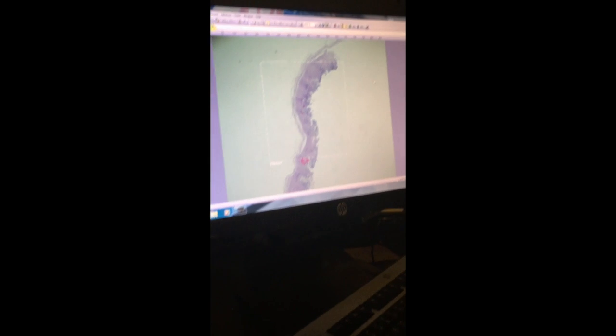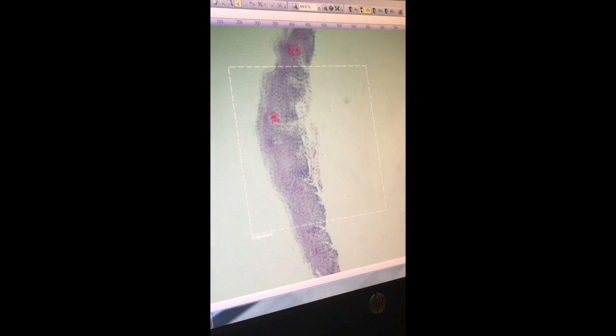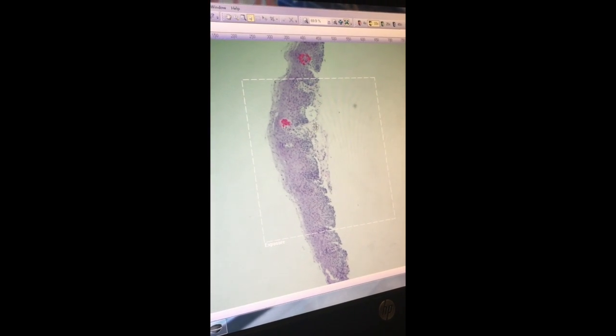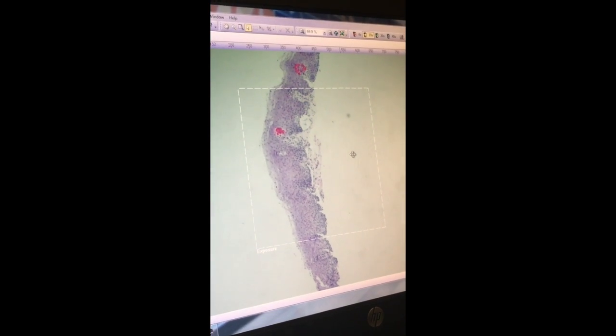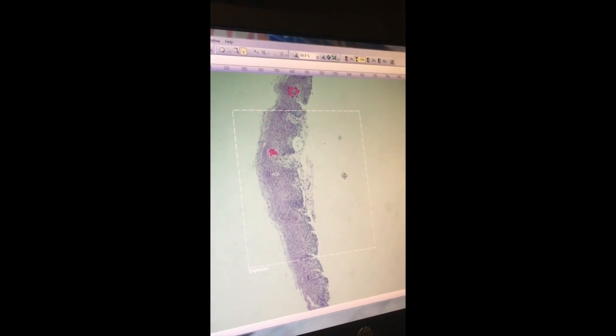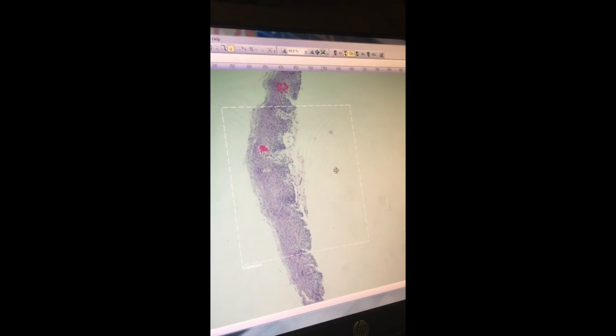Again, a lot darker of a purple. You can see a lot more red blood cells. Those are those big pockets of pink that you're seeing. And then right here is another cell layer. This is called lamina propria. The higher your eosinophil counts, the more fragile that tissue becomes, that we've noticed. And we've been able to publish on it, because you have so much degradation from the eosinophils moving within the cells. It's not very compact.